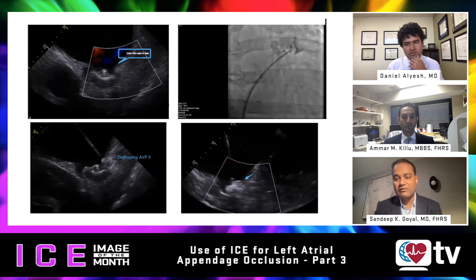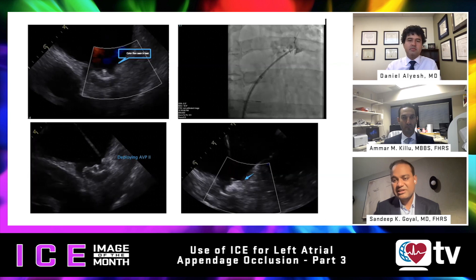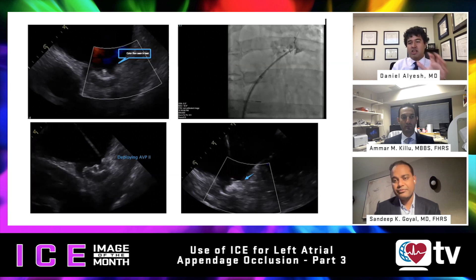Post imaging confirmed the leak remained closed on follow-up. This speaks to the value of intracardiac echo — this was a 45-minute MAC procedure. Compared to doing this under general anesthesia with TEE guidance, that's possible but not always necessary. As you gain more experience you can visualize smaller channels around the device. To what degree are you relying upon intracardiac echo versus fluoroscopy in your respective procedures?